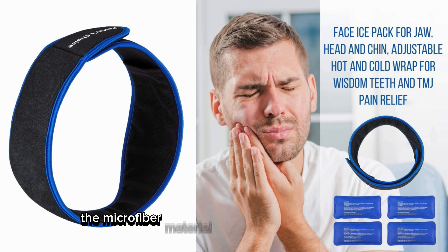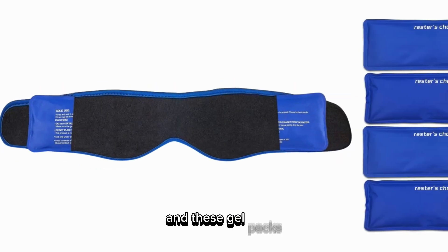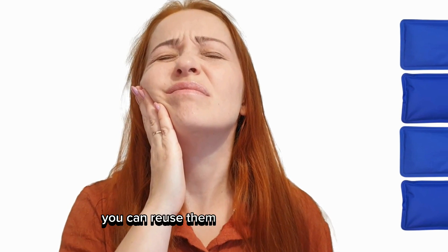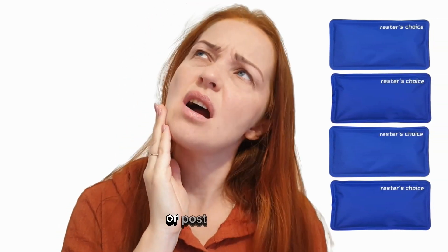The microfiber material is super gentle on the skin — no itching or discomfort, just soothing relief. And these gel packs? They're the heart of the product. You can reuse them whenever pain strikes, be it TMJ, migraines, or post-surgery pain.